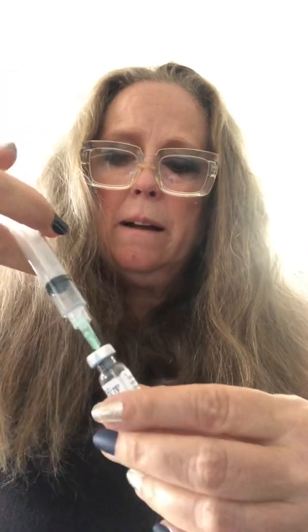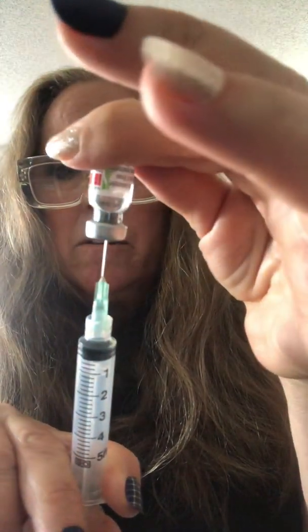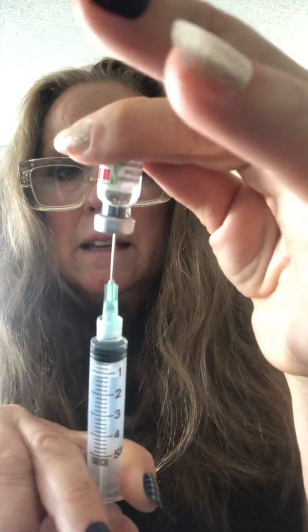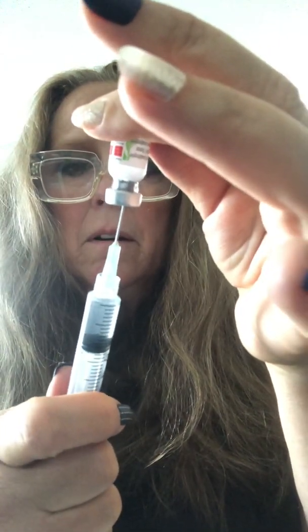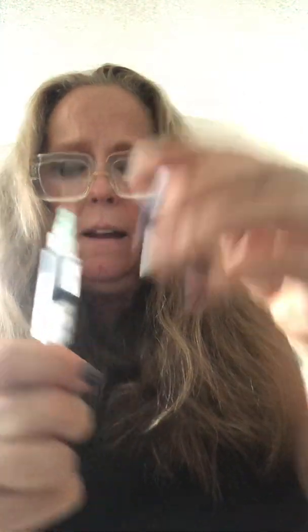Push it in — the air wants to come back out — and just tip it around until it mixes. There's a gap in the metal where you can see inside the bottle, so you can see the tip of your syringe. Just hold it like that and the syringe will usually pull back by itself. That's all the water out of the vial.